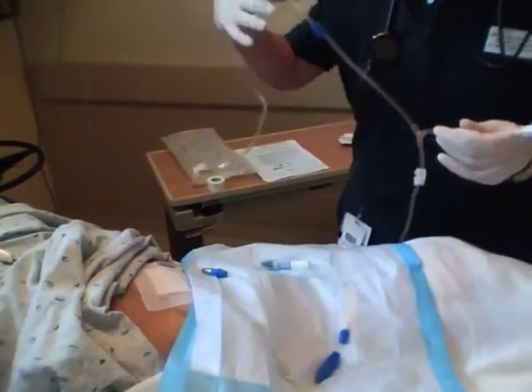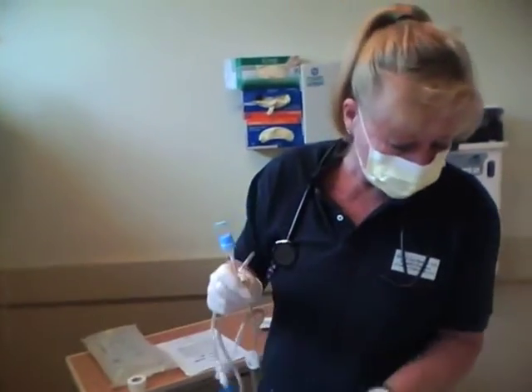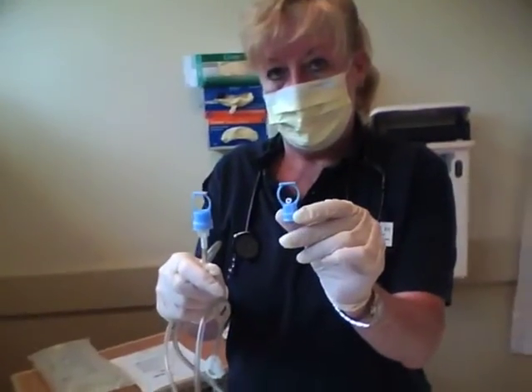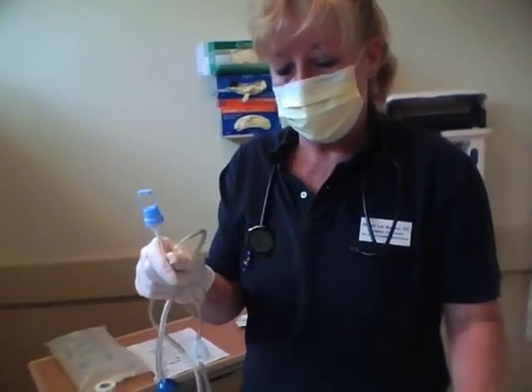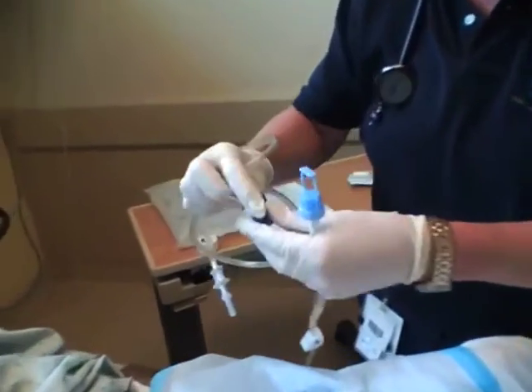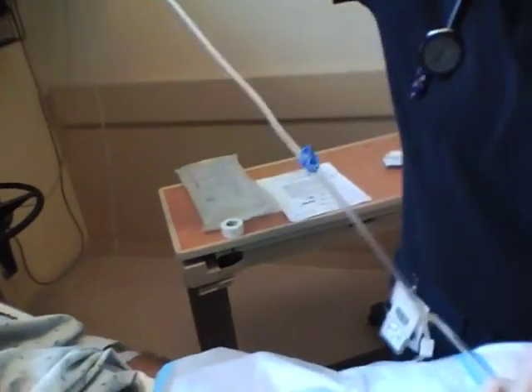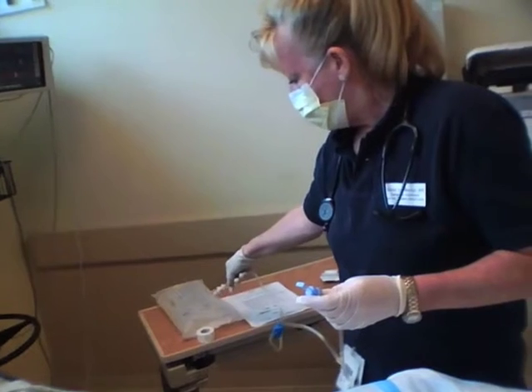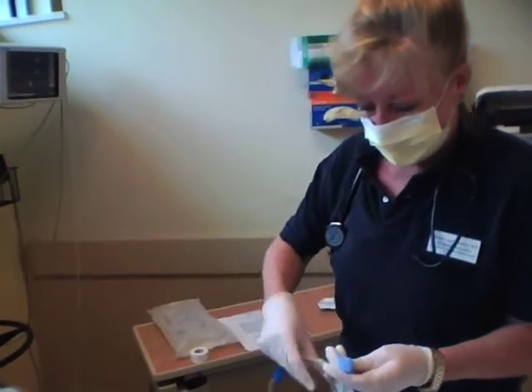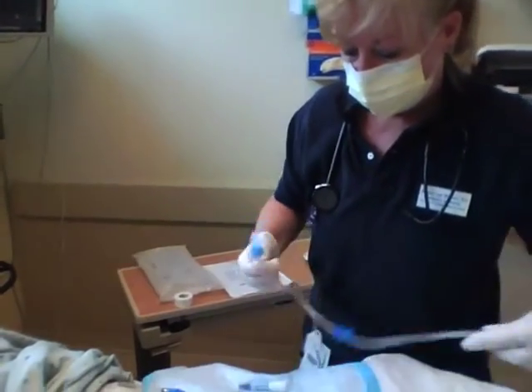And that's going to leave two connections — this is your Y connection. You can see those are the connections that are going to go together. You want to make sure they're both clamped here and here, and make sure all of your tubing is clamped. This is actually going to go into your dianeal bag. I'm just not going to spike the bag just yet. I'm going to make the connection for you to drain first, and then we'll worry about spiking the bag to fill.